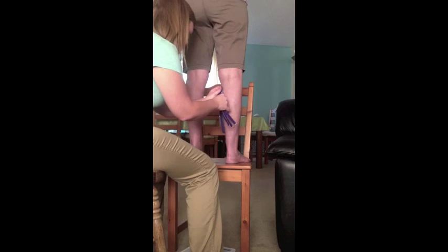Here you are going to see a circulatory lymphatic correction application. First, I have measured and cut two strips of kinesio tape.